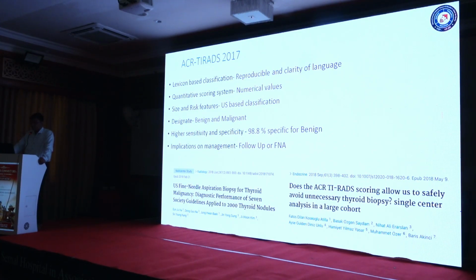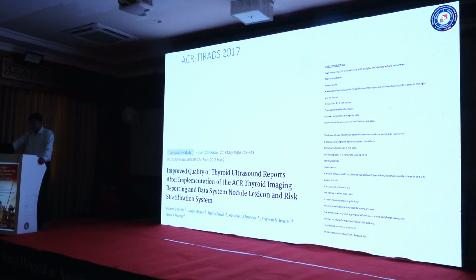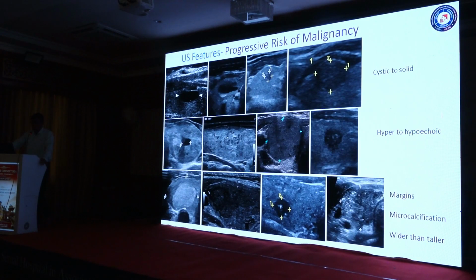a follow-up or a fine needle aspiration, and it also gives a lot of confidence to the radiologist if they follow this classification. But what we have to do is adopt the protocol with consistency. We have to educate regularly, do the training regarding these labelings, what the indications are, why the patient has come, whether it is new or a follow-up, how the images are required, how the imaging interpretation is done, and whether it is lexicon-based or not.